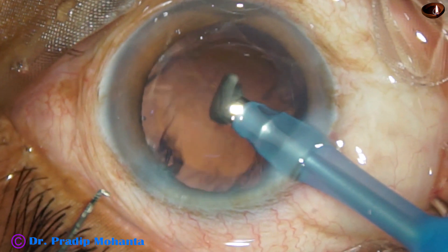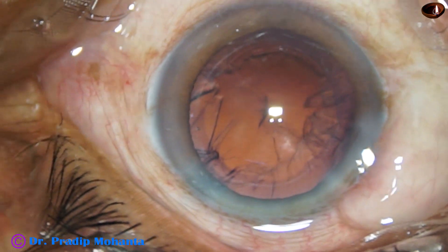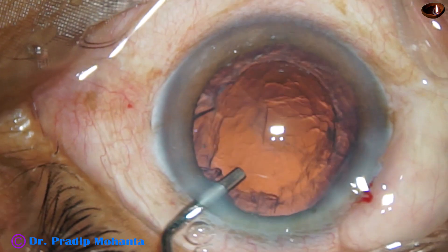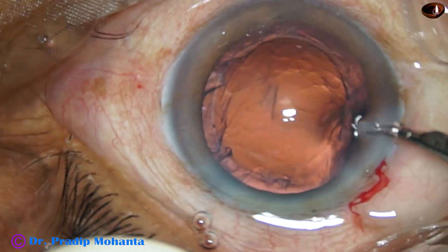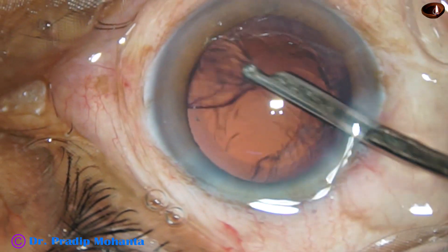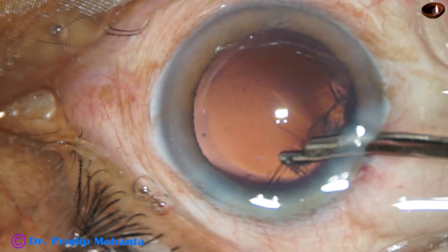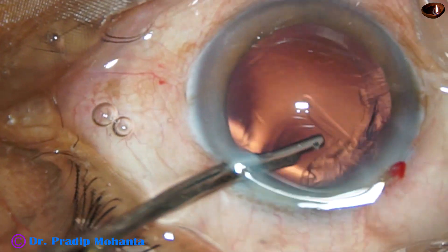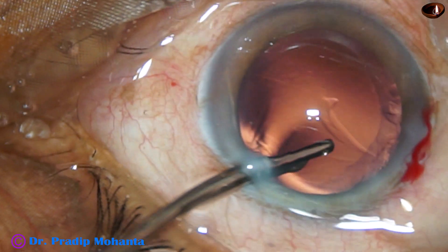The nucleus is managed nicely. The chopper is removed to make the anterior chamber more stable. Now cortical cleanup is to be done using a 23-gauge Simcoe cannula. Simcoe gives very good control, and with Simcoe, chances of posterior capsular rent during irrigation-aspiration is less than when irrigation-aspiration probes are used.